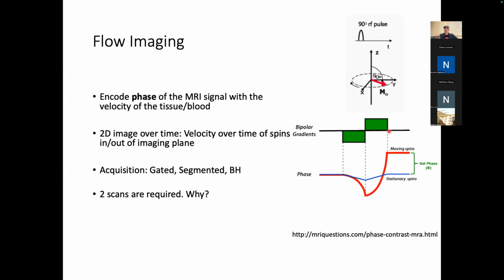So we flip what is positive to negative and what is negative to positive. And now if it has the same amplitude, the phase will catch back up to where it was. The first gradient pushed it here, the second gradient pushed it back here. And there we have zero phase shift by the end of this bipolar pulse. This is called a balanced bipolar pulse.